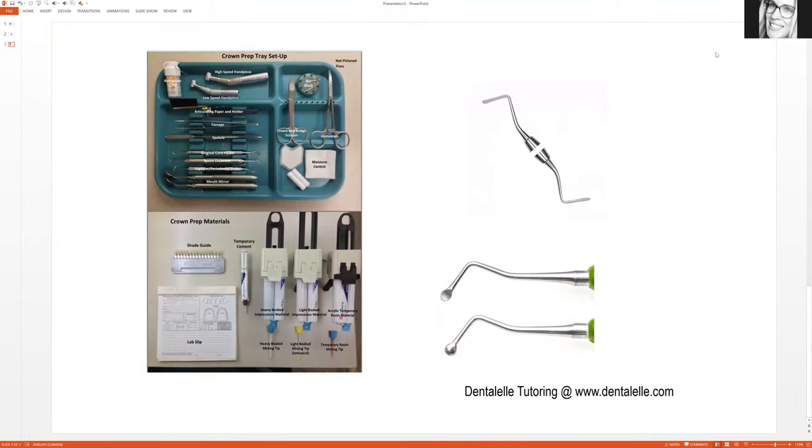Hello everybody, Andrea Majewski here with Dentalo Tutoring. In the video today we will be going over a crown prep tray setup. This could be used for a bridge prep as well, but just to keep things simple — bridges are basically the same thing as a crown prep but on a larger scale — so we'll be talking about the crown prep tray setup today.